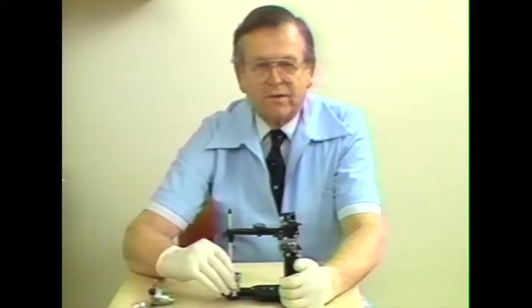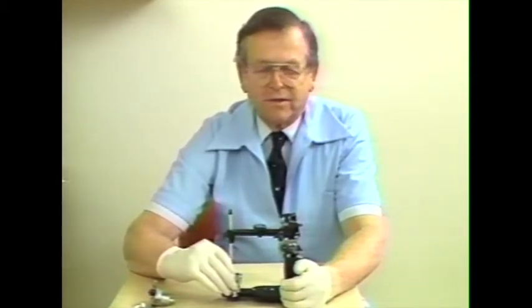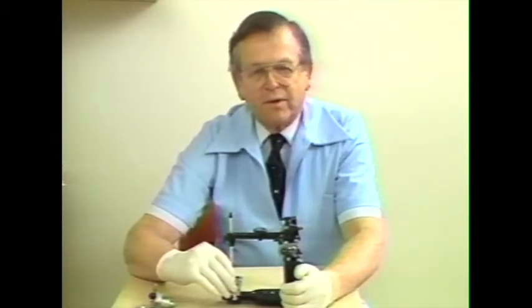Other important features of the modular articulator are that the parts are interchangeable. We've already shown you this with the interchangeability of the condylar elements. This requires very precise machining. Another very important feature is that casts can be transferred from one articulator to the other. This minimizes the need for extra articulators and improves communication between the dentist and the laboratory technician.